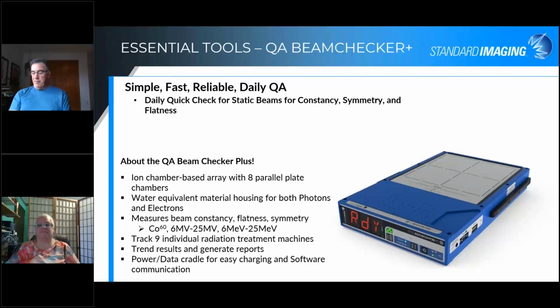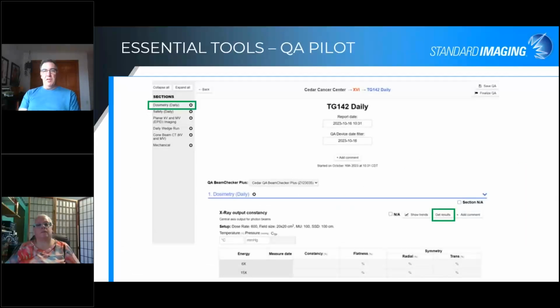It's interesting that they would refer to a QA device like that, but they have. Now, once we get that data, because the data will be stored in the unit up to 30 days' worth, and you can then upload that information to the PC, how does it get into QA Pilot, Andrea? What does that look like? Maybe you can go over that. Sure.